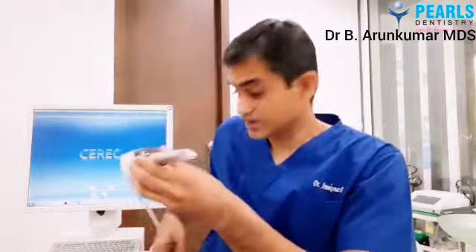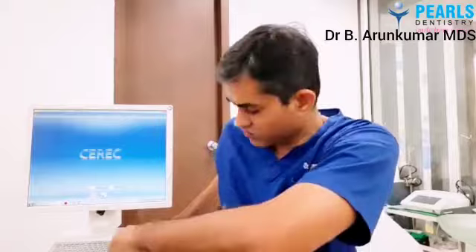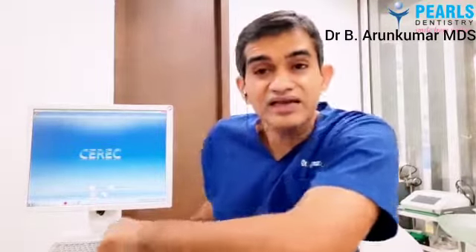So instead of the conventional material, we use a digital tool to capture the teeth and the oral structures digitally. Now what happens is, in the impression, we have a negative of the teeth that is being formed. Here we don't have the negative formed. We directly have the positive 3D reconstruction of our teeth that forms in the system real time. So that's the difference from forming an impression.